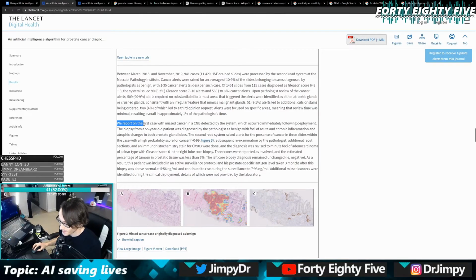This is important. This is actually the title of the stream. The reason why I've called it Saving Lives is because of this. We report the first case with missed cancer in a CNB detected by the system, which occurred immediately following deployment. The biopsy from a 55-year-old patient was diagnosed by the pathologist as benign. The second read system raised the alerts for the presence of cancer in 3 slides within the case with a high probability score for cancer, and the diagnosis was revised to minute foci adenocarcinoma.